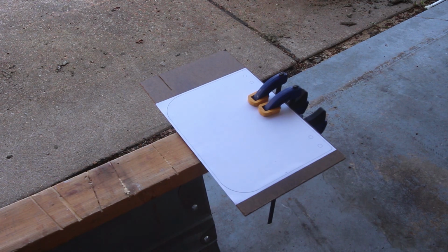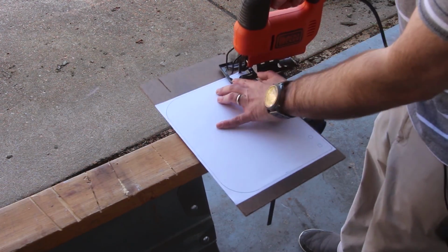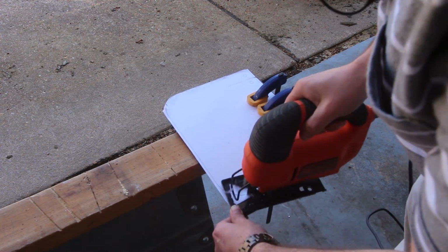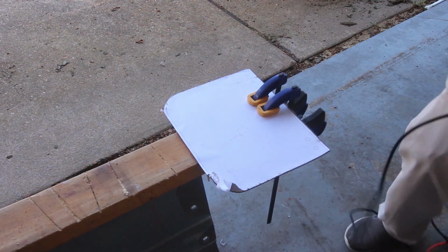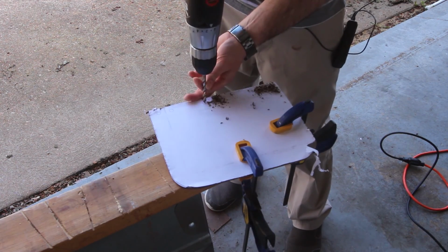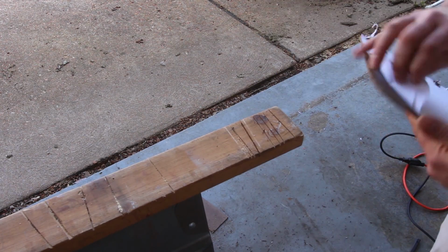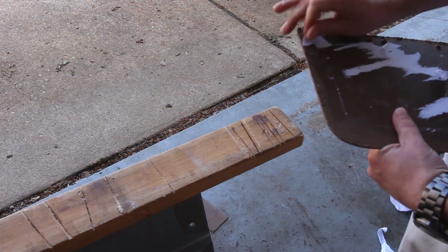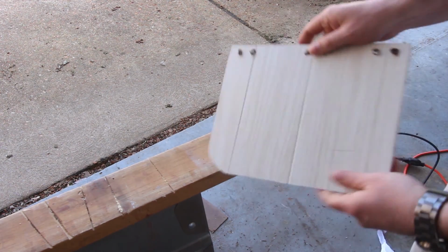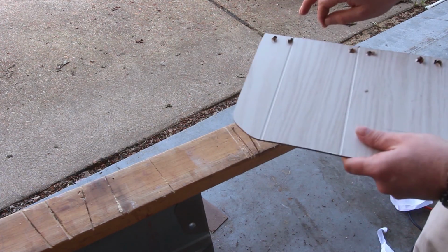Okay, so we've got our template secured, so let's go ahead and use our jigsaw to cut it out. Okay, so now we have a substantial face shield template that we can use to lay on top of sheets of plastic and mark the plastic and then cut it out. So here's our master template now.